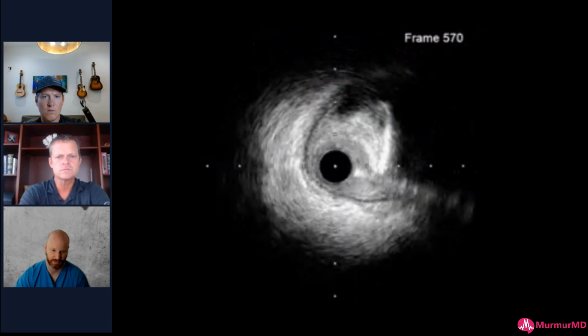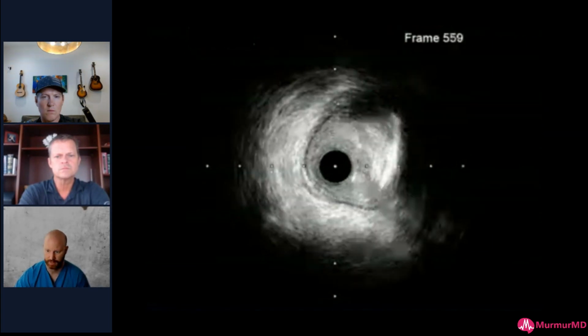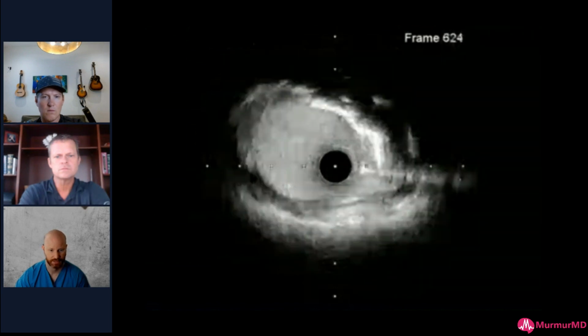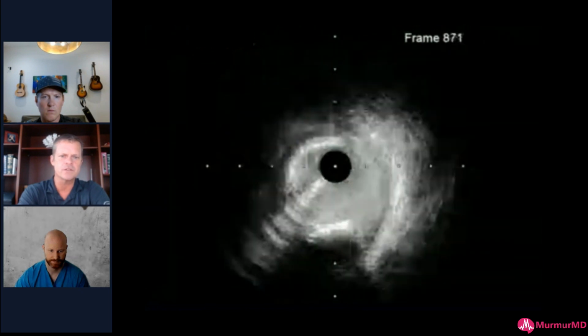I mean, it's really not the size of the vessel. And there's some more eccentric calcium. You can see how much bigger the vessel likely is than that stent. I'll go a couple frames back, but that stent is not the right size for this vessel. And then so how would you size here, Chris? I mean, you can see really the adventitia there.